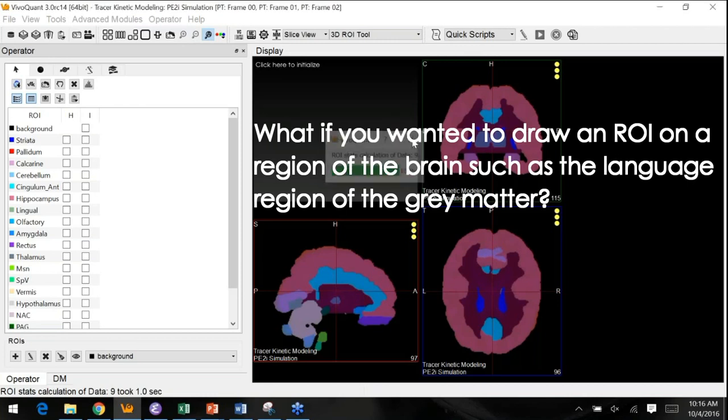No, this was just one ROI that I had previously segmented and opened up. But certainly you can draw ROIs on the spot, you can run even the Brain Atlas tool and then edit that atlas. It's very flexible in that regard.